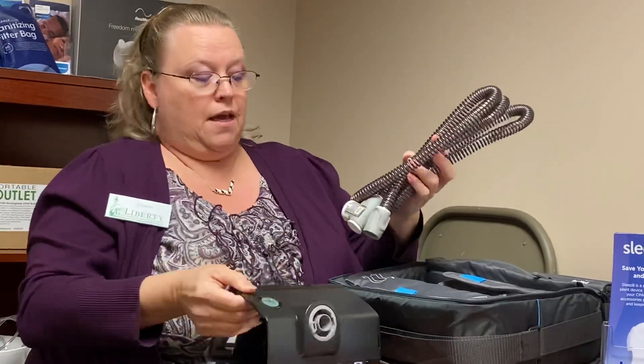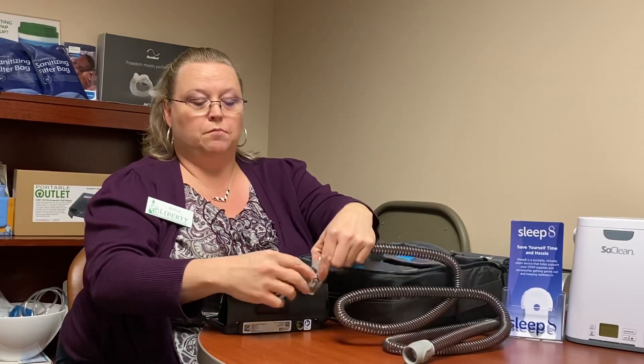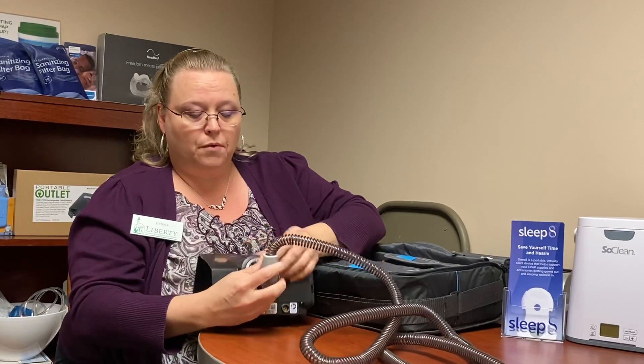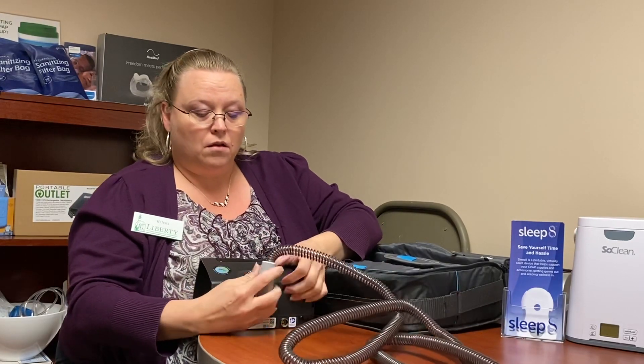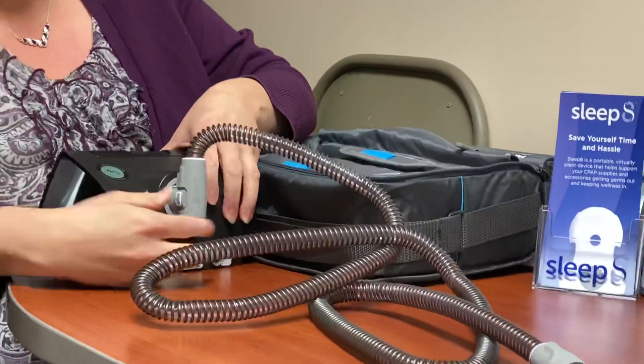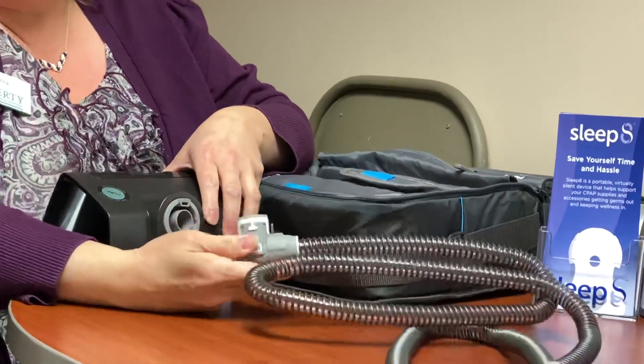Now your tubing is going to connect onto the back of your machine. There is a port for this tubing — right there, click that in. This does have a swivel and it will not come out unless you push on these two little buttons here. Once you pinch that, it will come out very easily.